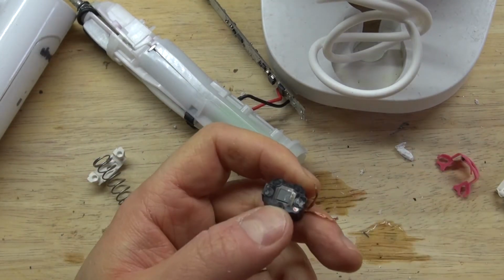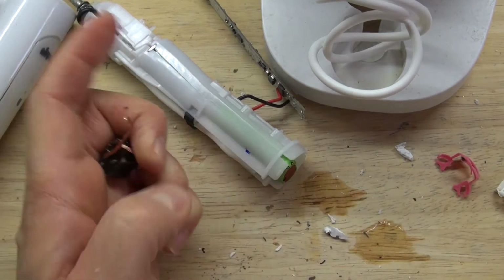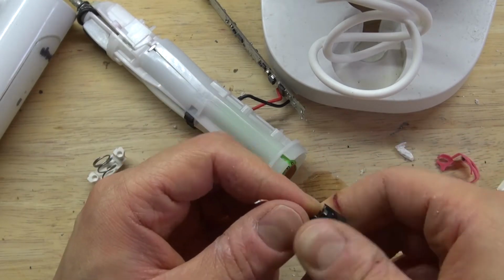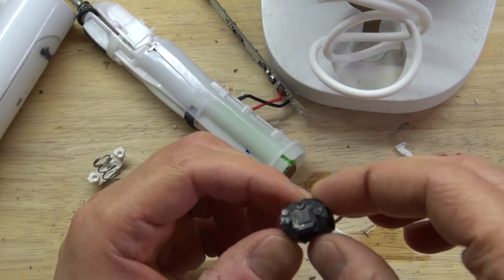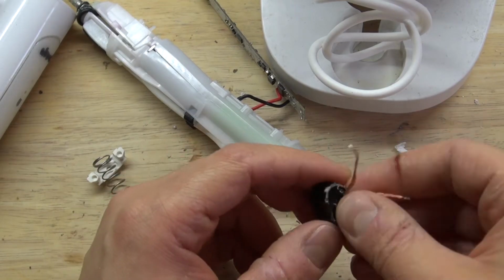Oh, how interesting. It's basically just a transformer. Makes sense, because if you have a transformer with a wire wrapped around the iron core, it creates an electromagnetic field that is focused in one direction. Now, if I were to take two of these and put them together, it creates a full transformer. Normally in a transformer, there are two coils, one that is the primary coil, and the other is the secondary coil.